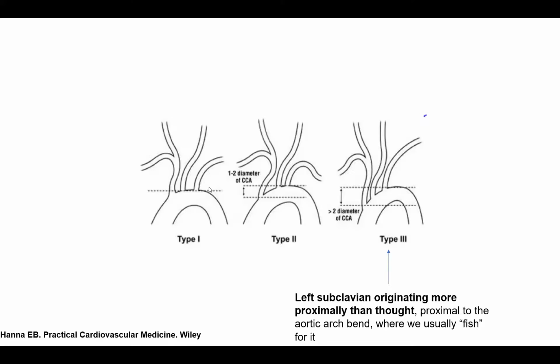Most often the arch is one of those two, so you pull with a counterclock and you fall into those supra-aortic vessels. On occasion, your arch is like this. Most often you're maneuvering in standard cases into the horizontal portion of the arch, and you're aiming for the distal portion of that horizontal arch, which is where the subclavian is.